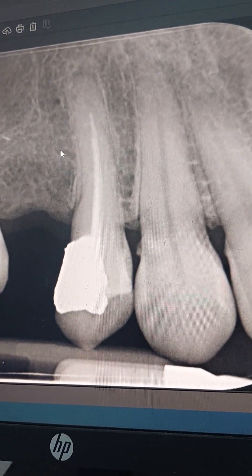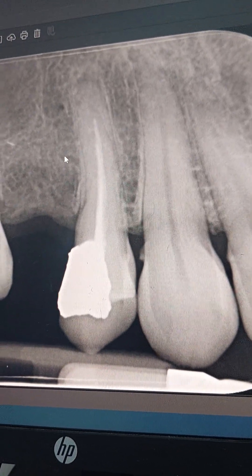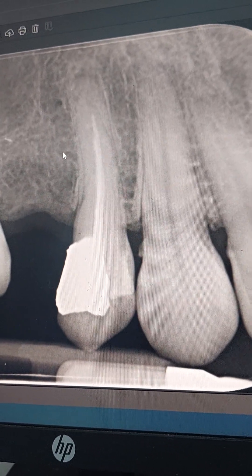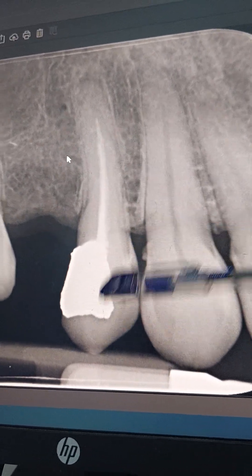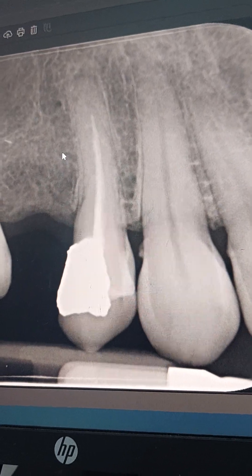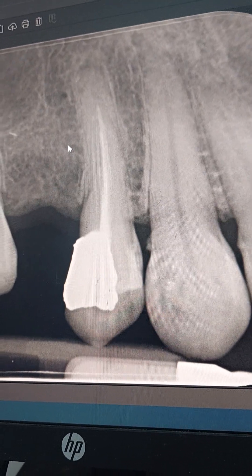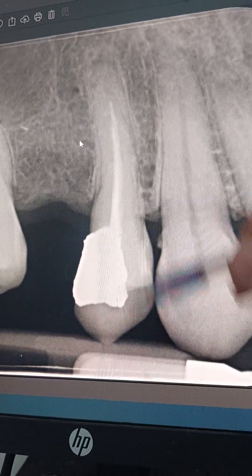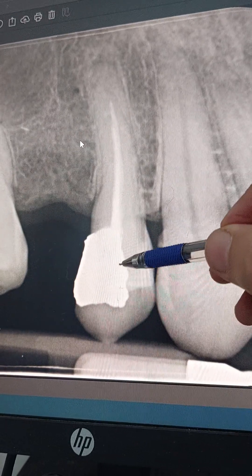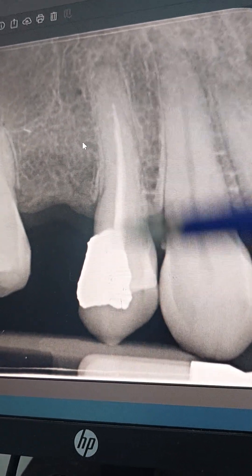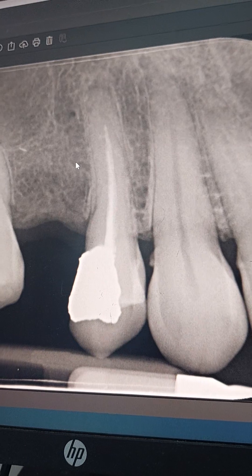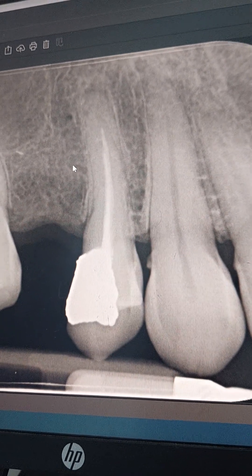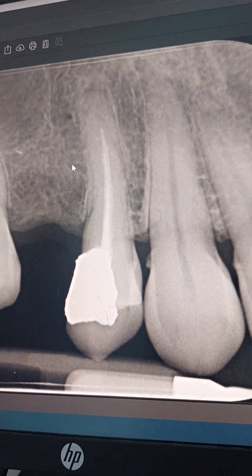If we have a good coronal seal and a complex, expensive restoration on top — like an excellent zirconia bridge or crown — and we don't want to ruin the occlusal work, then we approach it apically. The determinant is whether we can retreat it from the coronal side. In this case, retreatment is definitely needed — the endo is short and not well condensed.